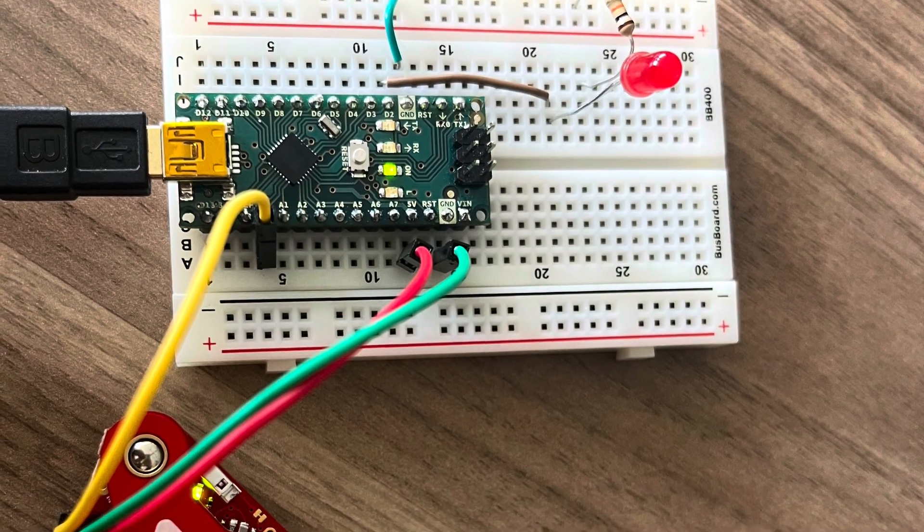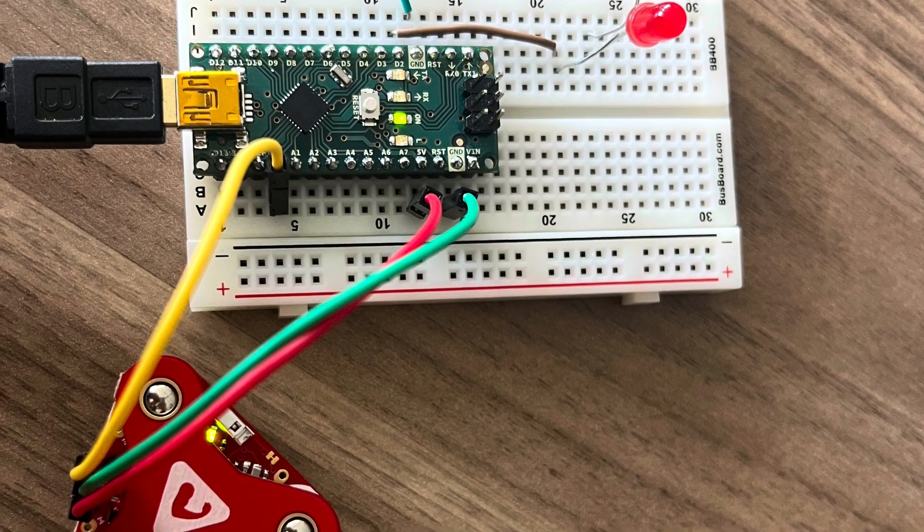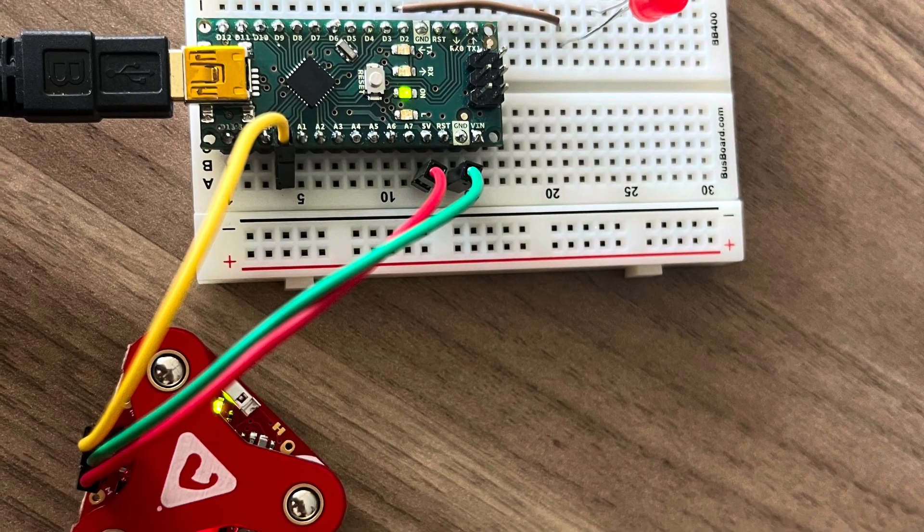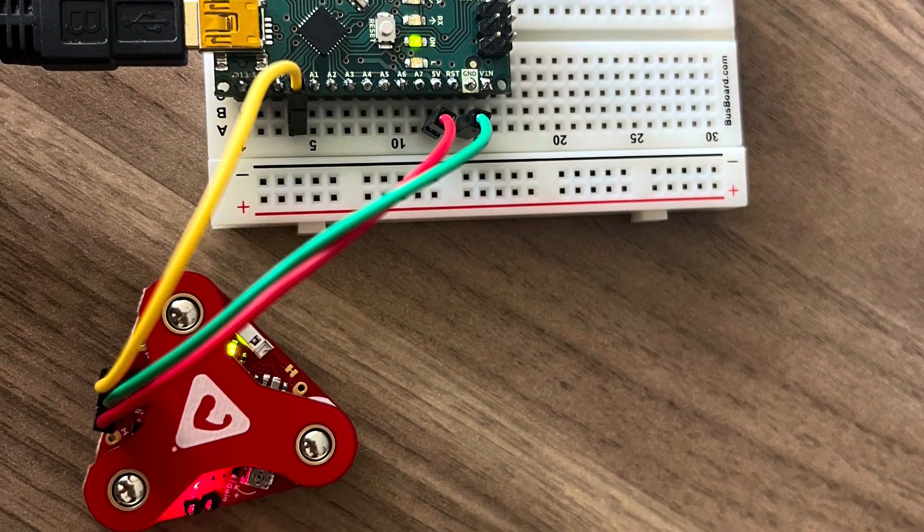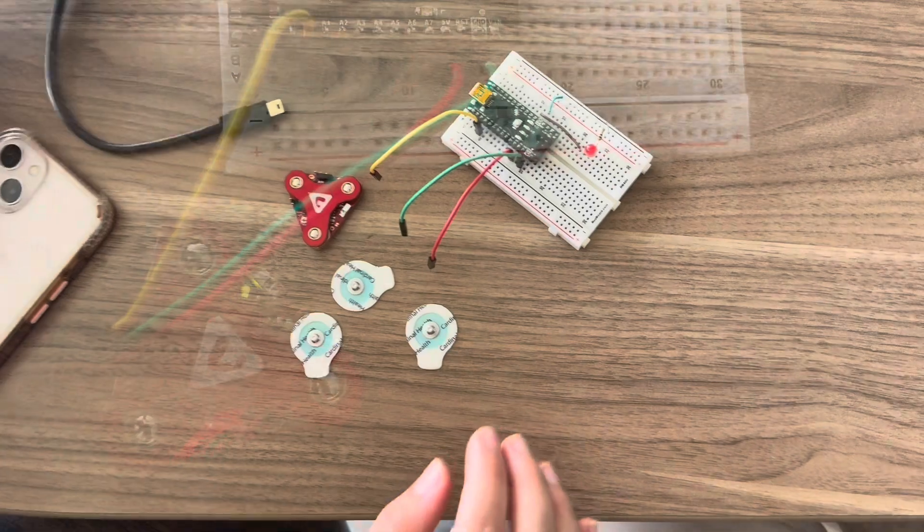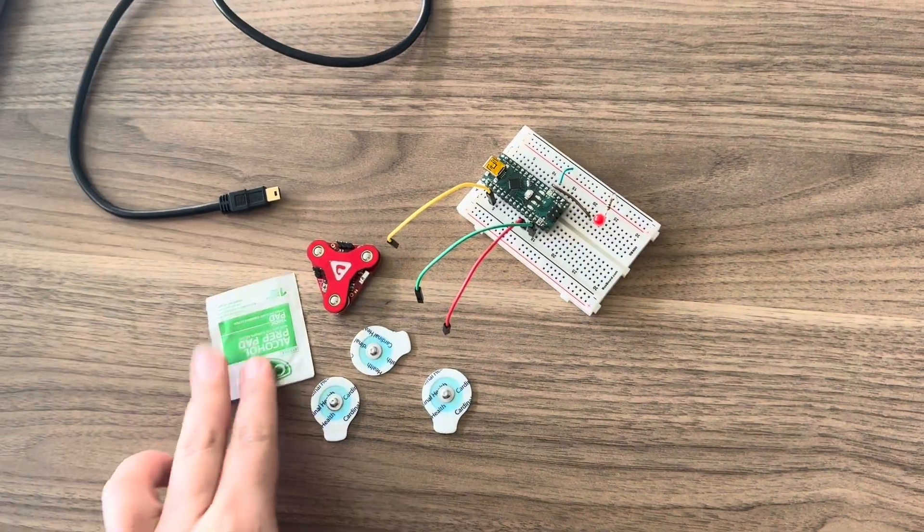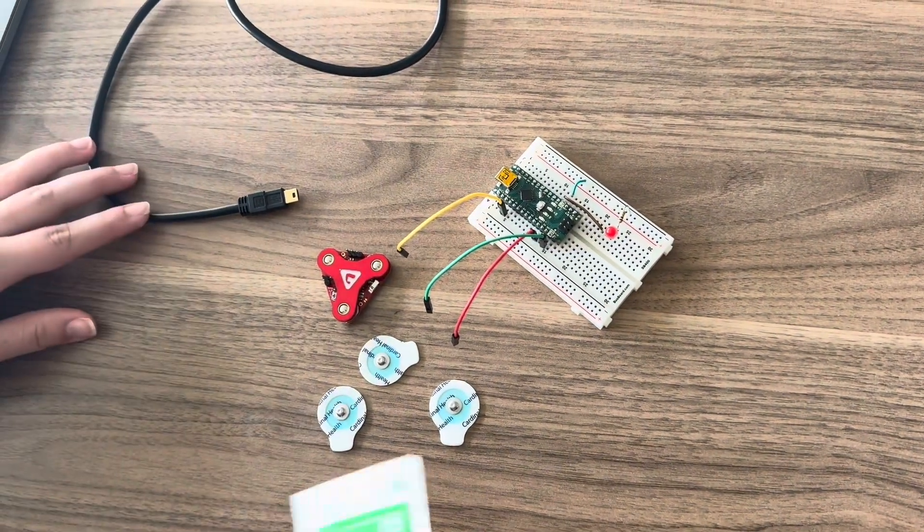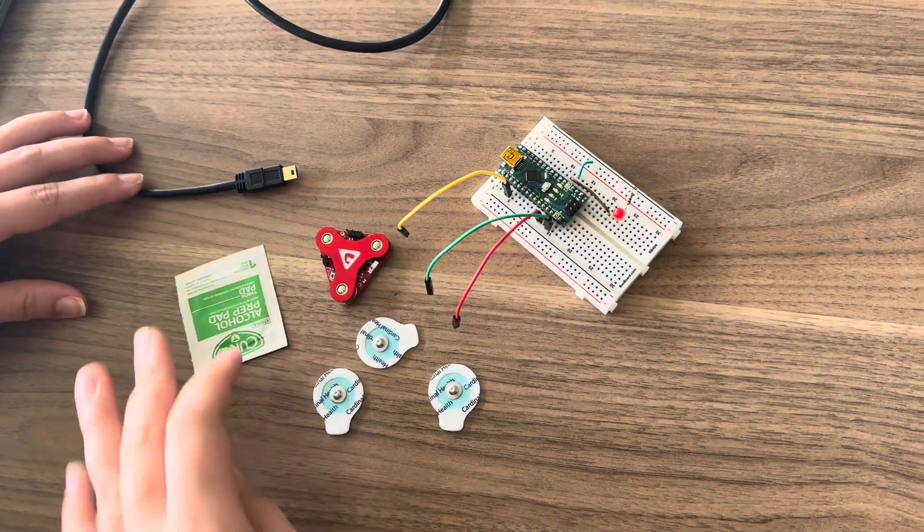This is the device that we constructed and it has all the same components as the previous slide. Now we will show you the actual process of putting the device on.